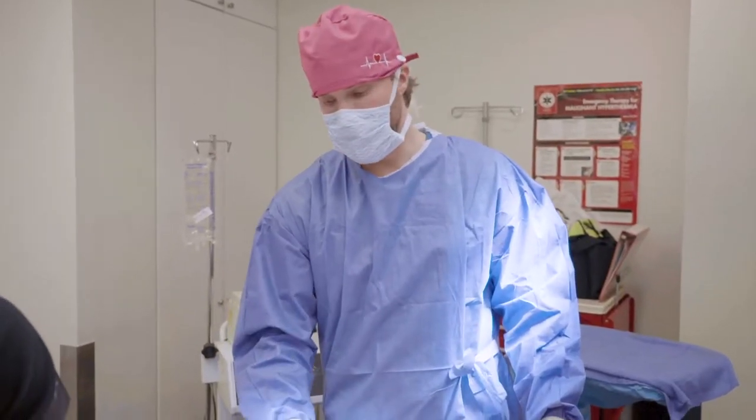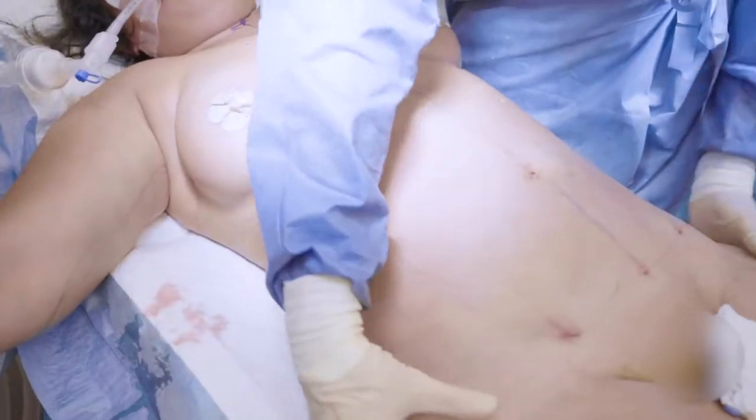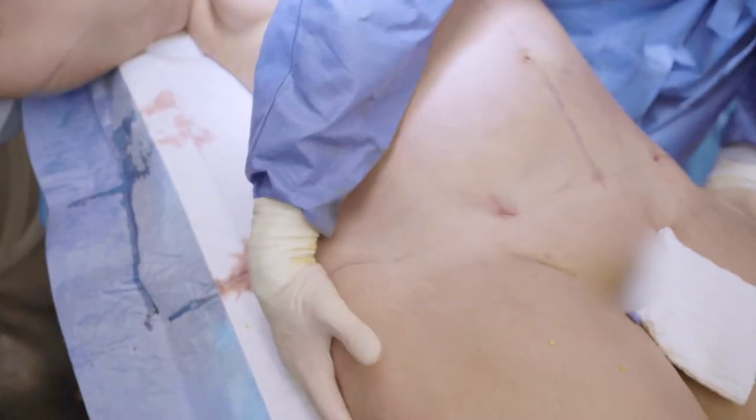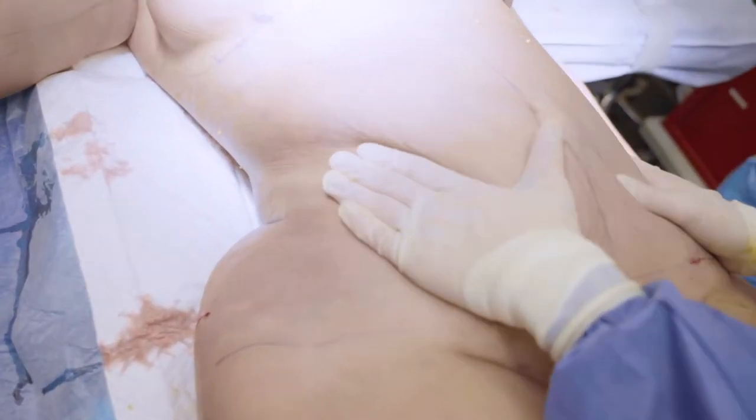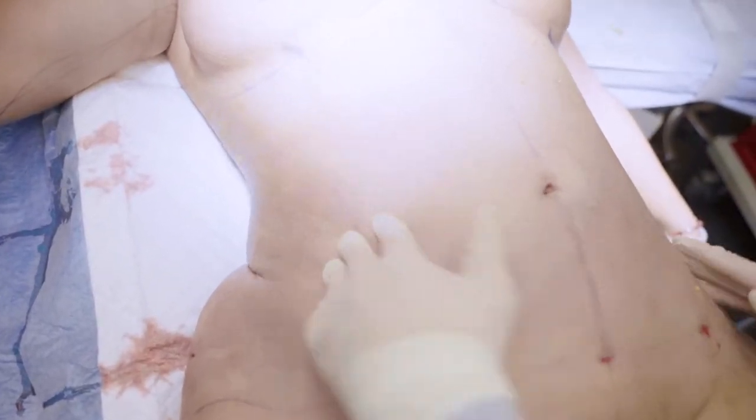We finished the BBL — next is the breast augmentation. The shape looks like this: the waist is as narrow as it could be. She wanted the hips — she got the hips and the butt. Look at the waistline — it's in. The stomach is as flat as it could be. She has an hourglass silhouette.